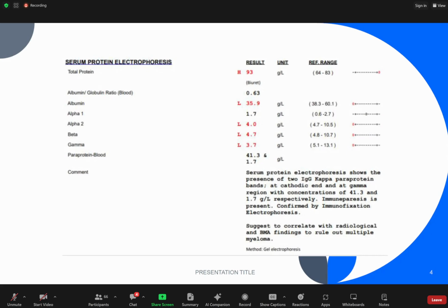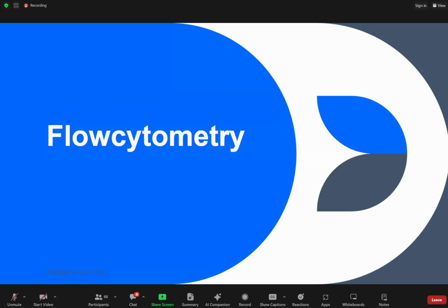I think I'd just like to mention that when we saw earlier, the aspirate actually didn't show much plasma cells. So when we did the IPT here, we informed the pathologists at the district hospital to review back. They stained the other slide that they had, and only on the other slide did they manage to get the same picture as us, a lot of plasma cells.